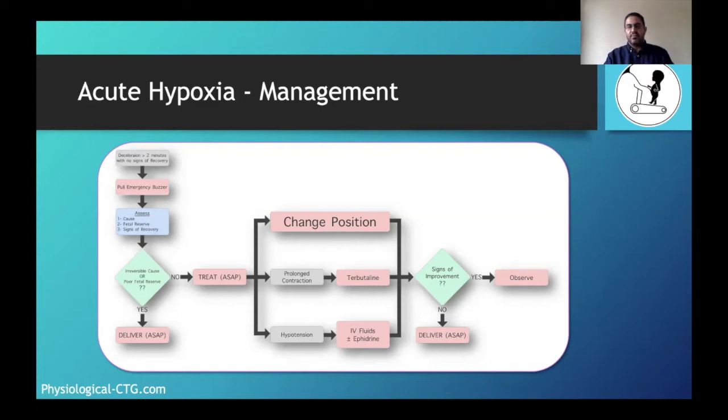Okay. Signs of baby getting worse. So what would I see on the trace if the baby is getting worse? I need volunteers to answer. Otherwise, I'll start picking names.